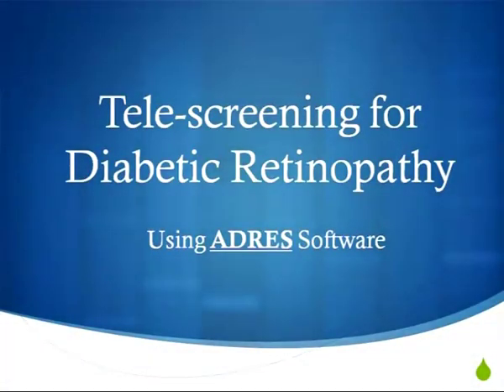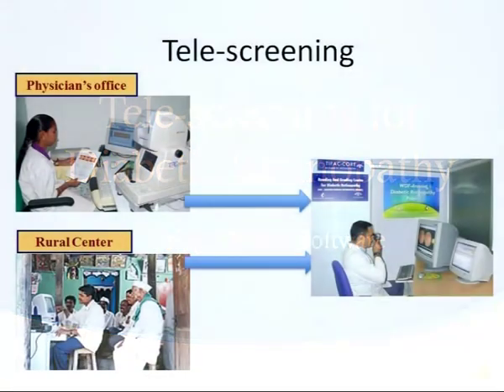Screening for diabetic retinopathy is important to prevent needless blindness. In areas where ophthalmologists are not available, tele-screening for diabetic retinopathy will be very helpful, especially in rural areas. You can also use tele-screening in diabetic clinics when diabetic patients come for their routine periodical diabetic checkup, and this opportunity can be used for screening their eyes so that the DR changes in these patients can be diagnosed early before loss of vision occurs.